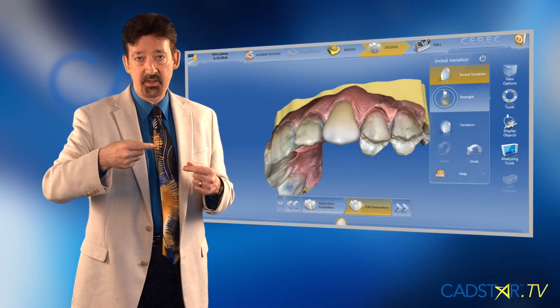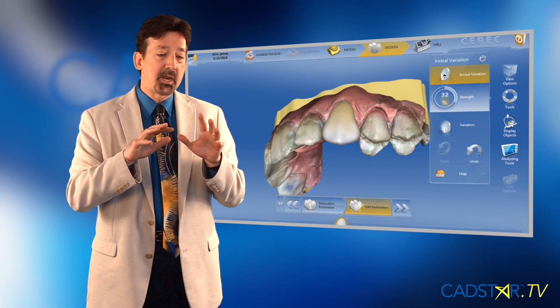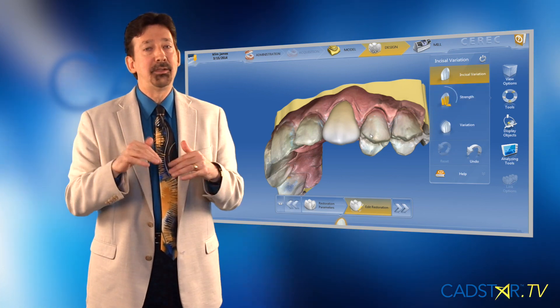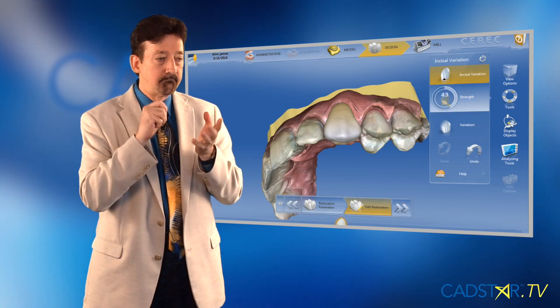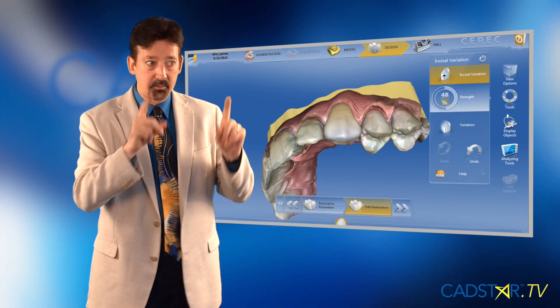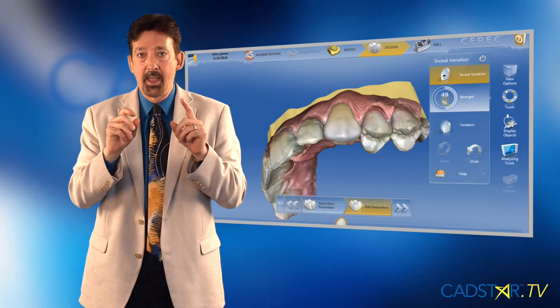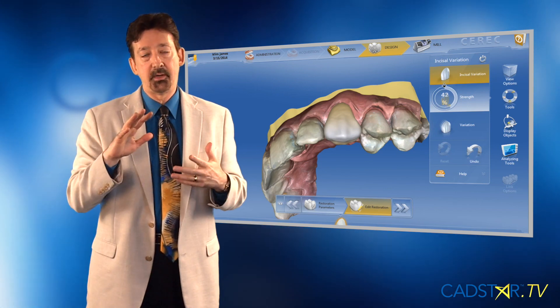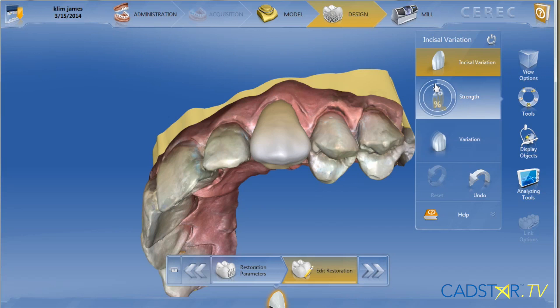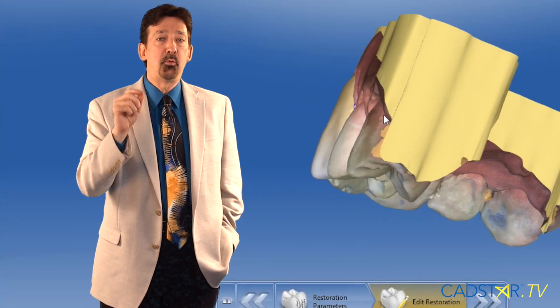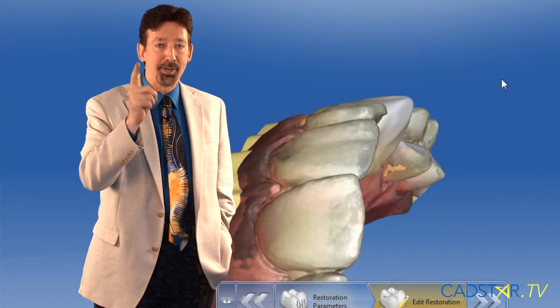Now, here's one caveat. When you're applying your labial contouring using incisal variation, you want to get the look you want by scrolling — we're very visual people, so we're looking at it on the screen and getting that beautiful contouring. Then what you want to do is close your eyes and add about another 15%. When you add another 15%, it's going to look a little rowdy, but that will mill to what you saw you liked.